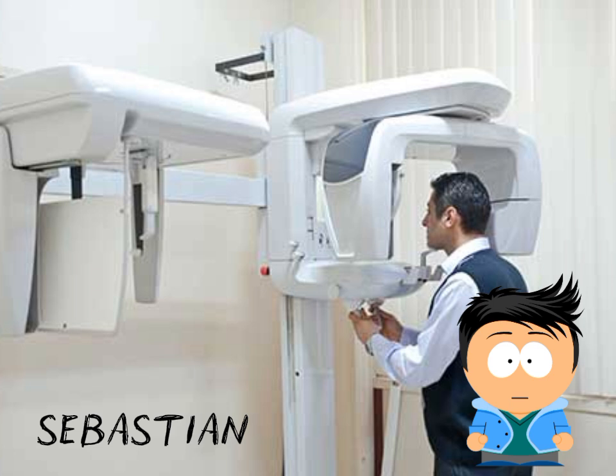Modern models are equipped with touchscreens. During operation, the patient is positioned to bite a guide and the rotating arm is synchronized to emit radiation. The sensor is exposed to create an image.